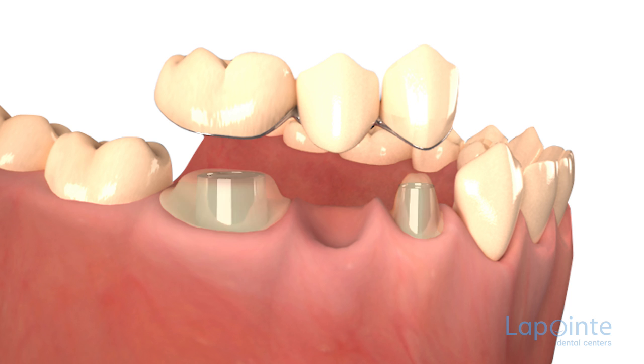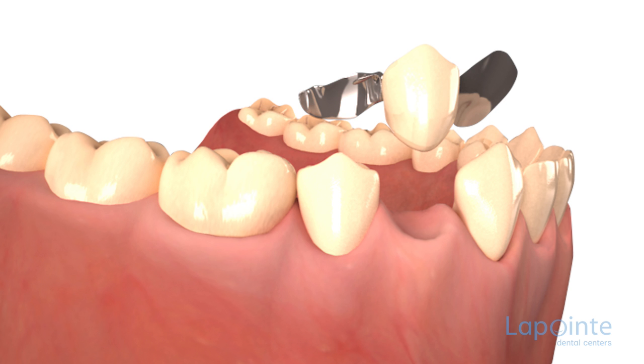Bridges belong to the family of accessories aiming to fill toothless spaces. They are made up of one or several porcelain teeth attached to the nearby teeth. To affix the bridge to the neighboring teeth, we proceed in different ways.